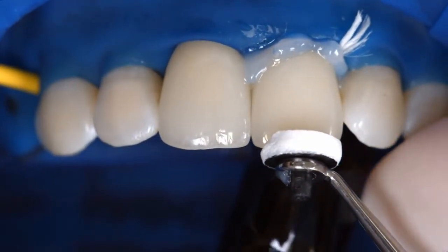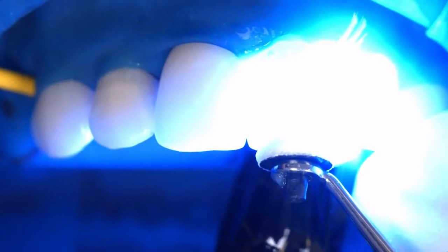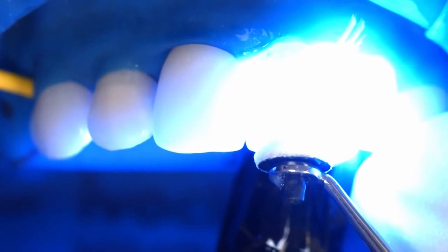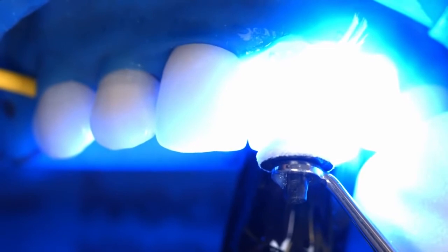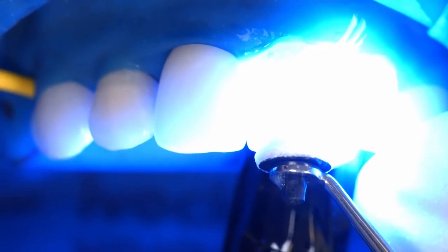Light cure all cement lines again for 10 seconds per segment and per millimeter ceramic, using for example Bluephase Style at a light intensity of 1100 milliwatts per square centimeter.